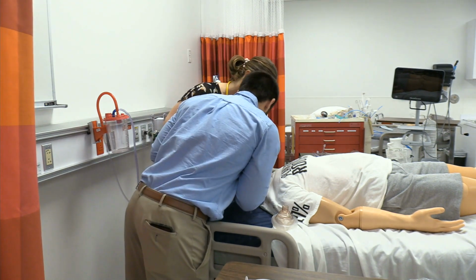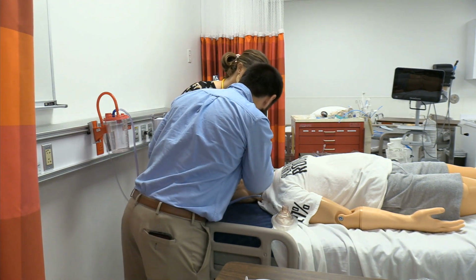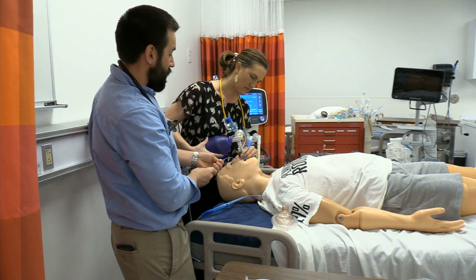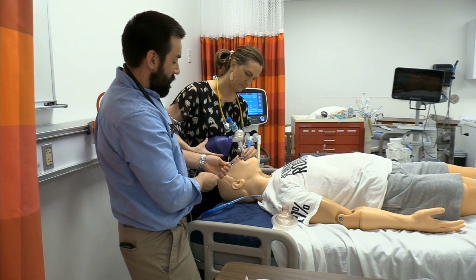Where are you at? You said 26 at the teeth. So let's go back to like 20. He's not that tall. Let's go back 3 centimeters, okay? So take it to 23 once I drop the cuff. Okay. And tell me when you're back, and I'll reinflate.